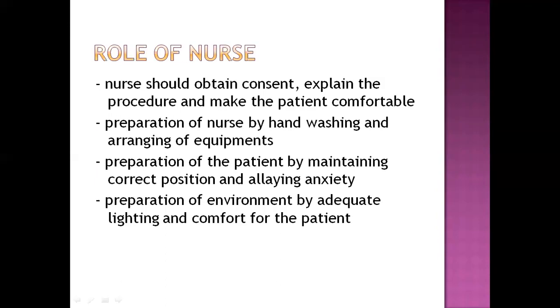Role of nurse for this test can be, nurse should first of all obtain consent, explain the procedure and make the patient comfortable. Nurse can prepare herself by hand washing and arranging all the equipments needed. Patient should be prepared by the nurse by maintaining correct position and allaying anxiety. Normally, this test is performed by providing patient with a sitting position, and nurse also maintains sitting or standing position.